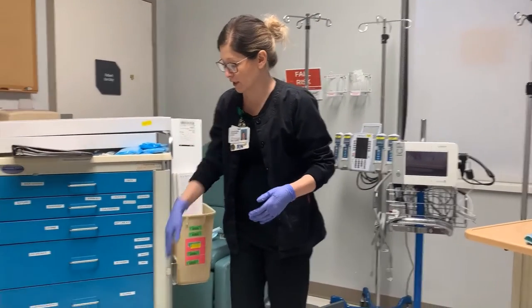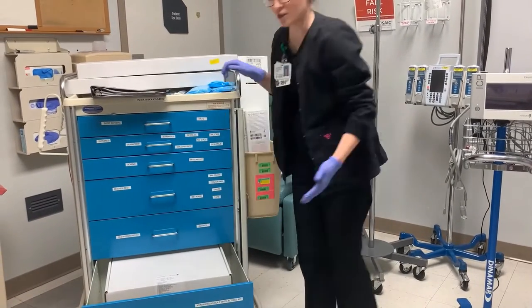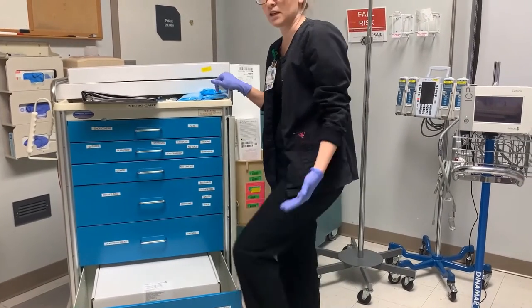You're going to come down here and grab the intracranial access kit — this big box right here — and hand that to the surgeon. Lidocaine with epi is in the Pyxis if they ask for that, so you may need to grab it out of the Pyxis.